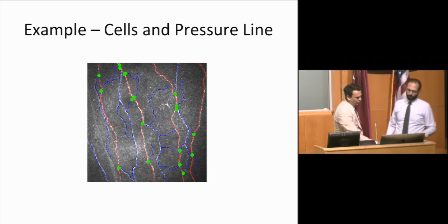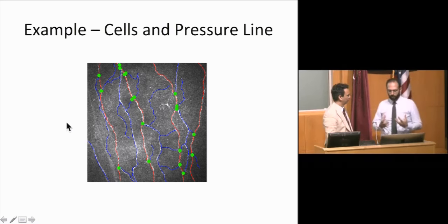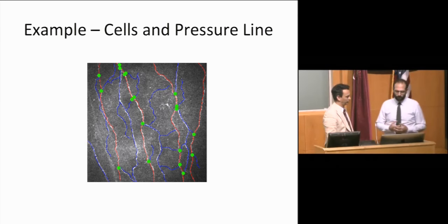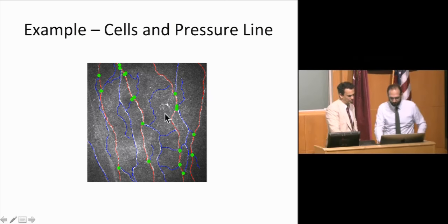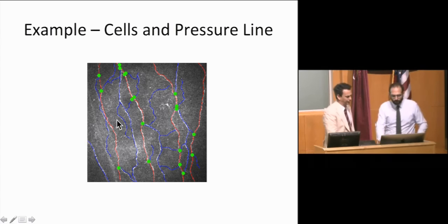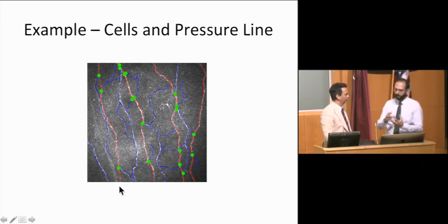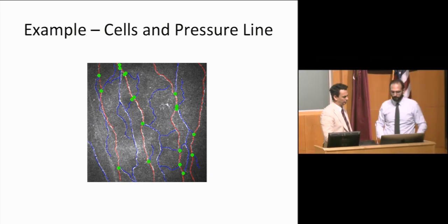I've got a question. I know you may say that this line here is the pressure, but how can you distinguish it from a main fiber because it's also white? So that's a good question. A feature we use, which is very important to do exactly this, to distinguish the nerve fiber from everything else, is beading. So nerve fibers exhibit beading and other structures do not. You can see here, for example, that the cell here is not beaded. It's a uniform white color. Similar for this area here, you cannot see any beads. And at the same time, you cannot see any cells or anything. So it's just a very mild change in contrast, which means that this is probably an incomplete touch between the microscope and the eye of the patient, or a very simple move from the patient themselves. So this is why we say this is a pressure line.